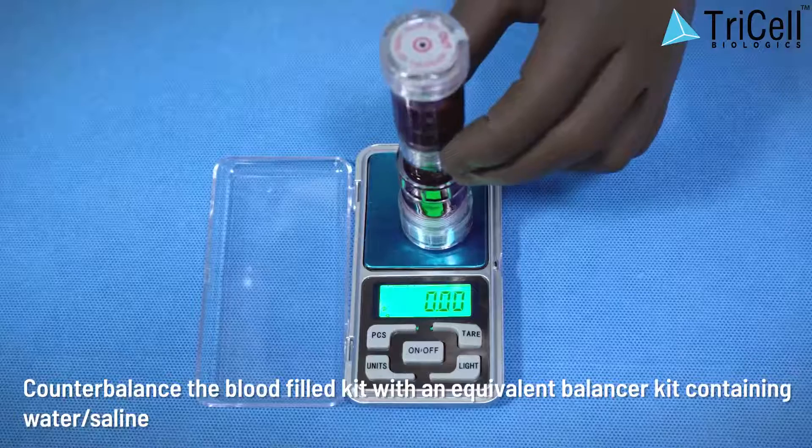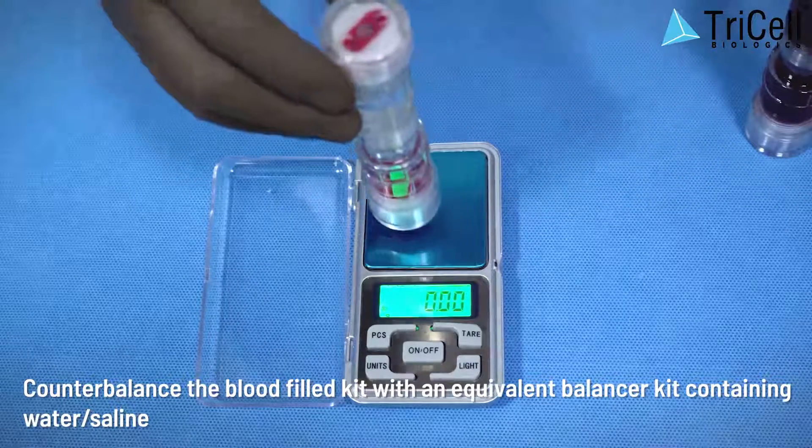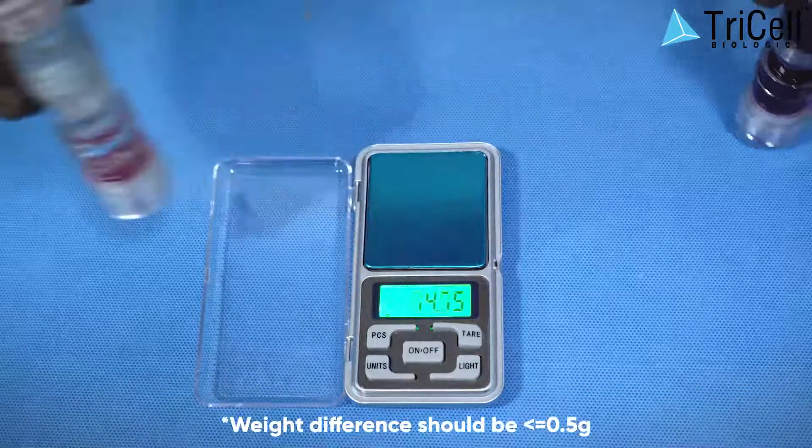Step 4: Counterbalance the blood-filled kit with an equivalent balancer kit containing water or saline. The weight difference should be less than or equal to 0.5 gram.